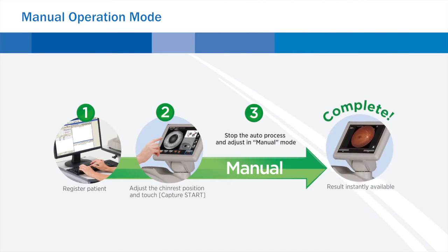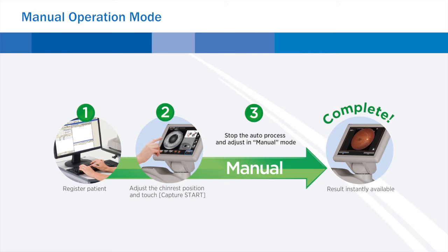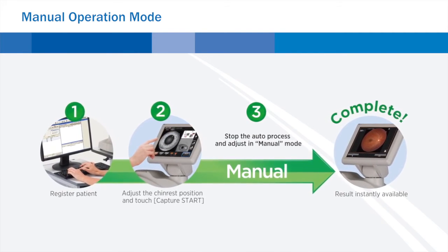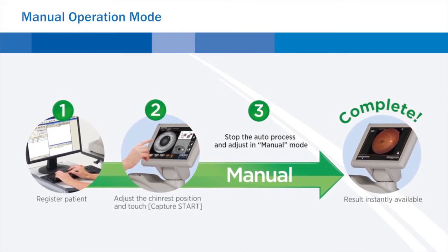In manual mode, alignment is adjusted by a finger touch on the screen, and illumination, flash intensity, diopter adjustment, and internal fixation targets can be adjusted.